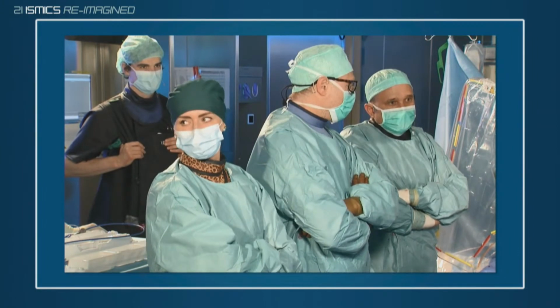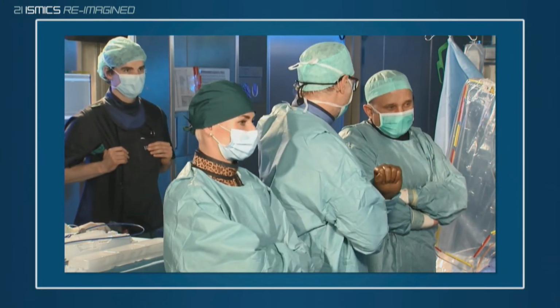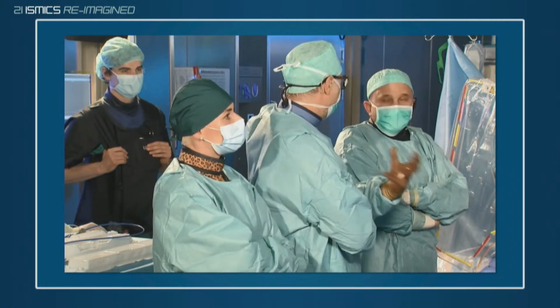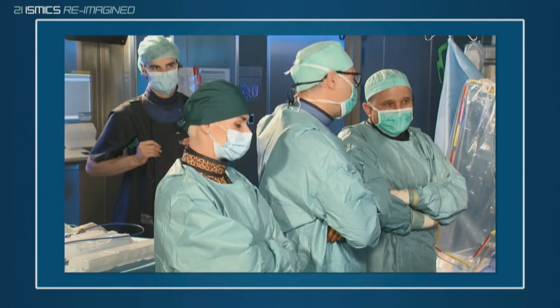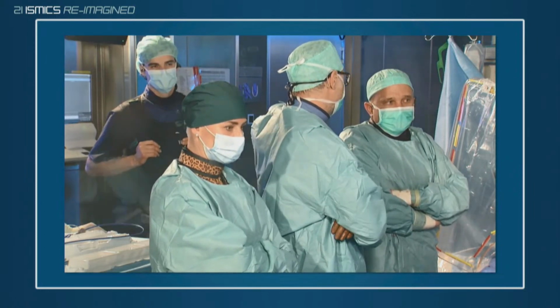On the other side, you want this to be her last valve ever. So to optimize anatomy for better flow through the valve, if there's possibly not a full expansion of the valve, I think that's an argument for balloon dilatation.